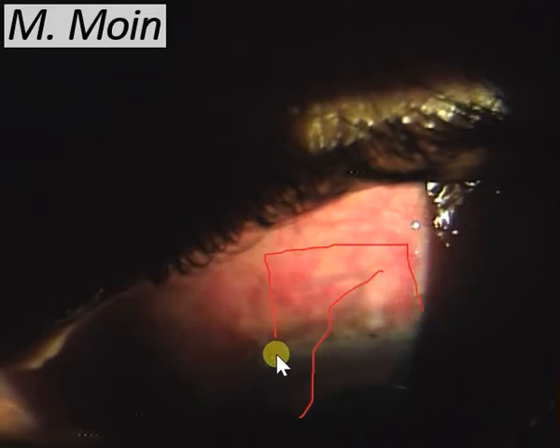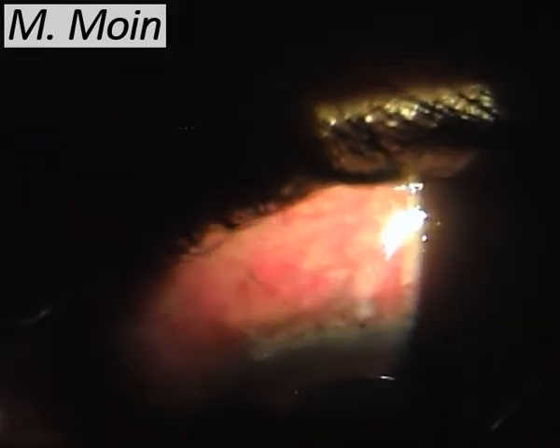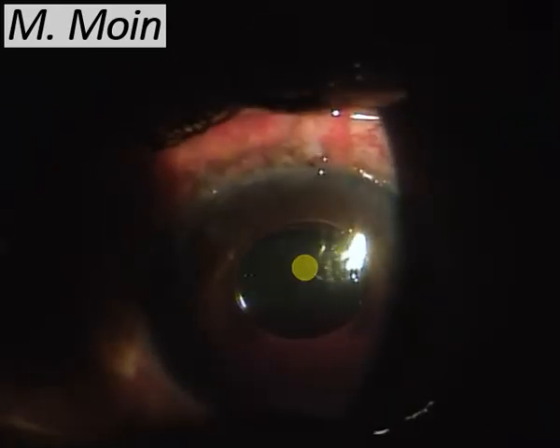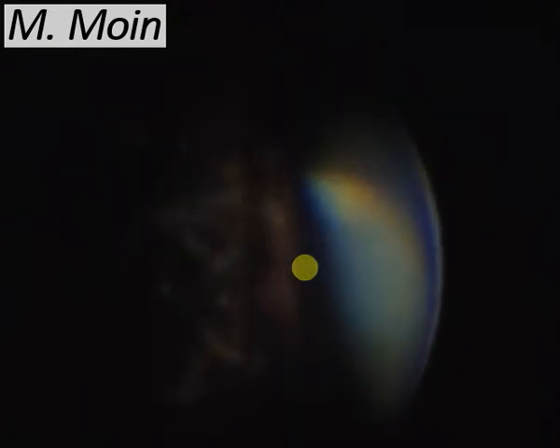There's a releasable suture going over here. This is the conjunctival suture here. This is the area of subconj hemorrhage. So if you have a very neat dissection, you will tend to see structures beneath your dissection the next day after surgery. That is sometimes very helpful for you. This is the area of the bleb which you're seeing. The height of the bleb is not very high. So what I tend to do is keep one releasable suture tight and one suture loose. That will help me to form the anterior chamber.